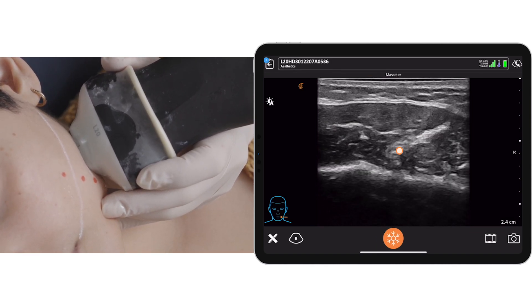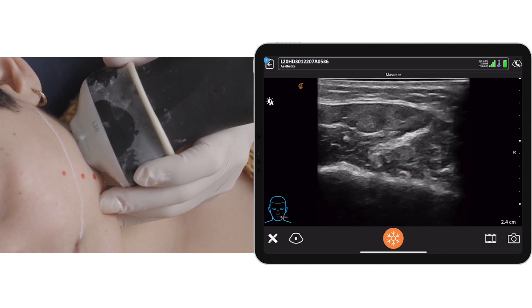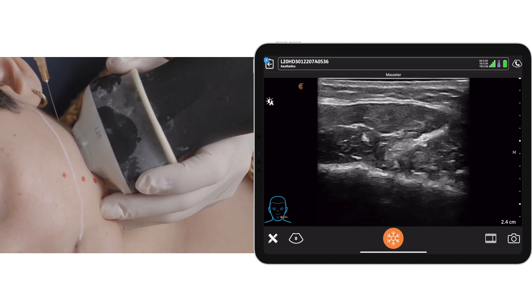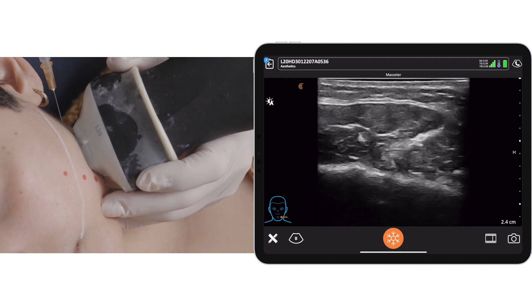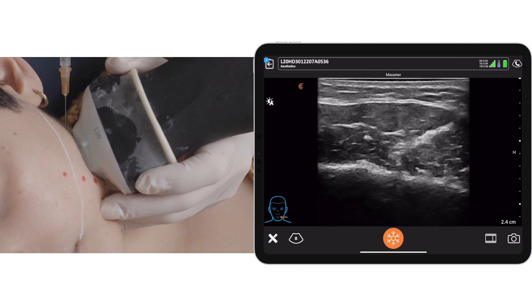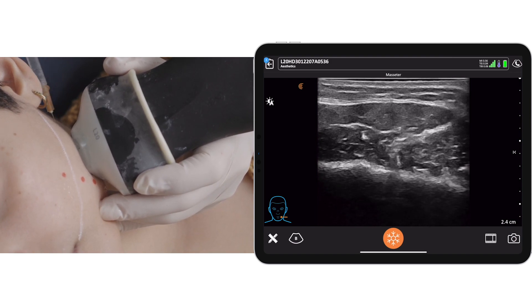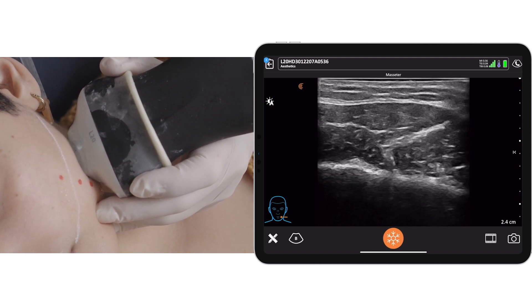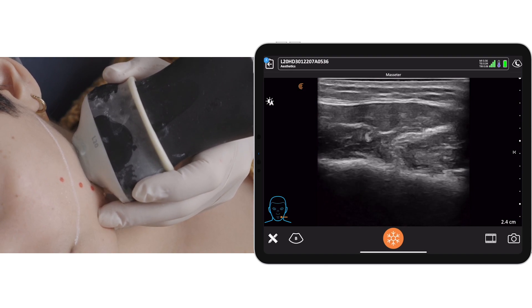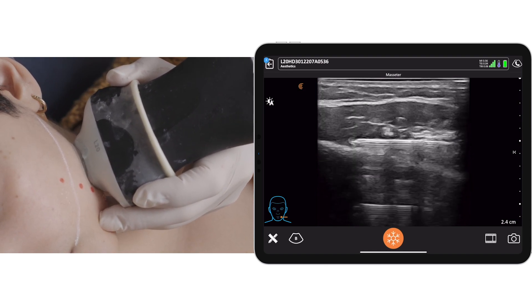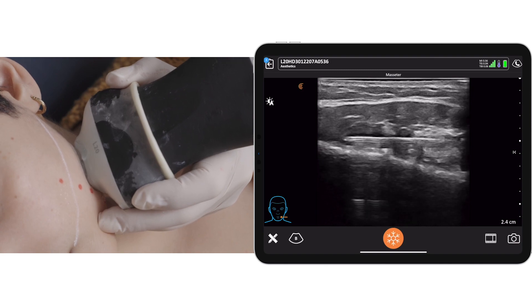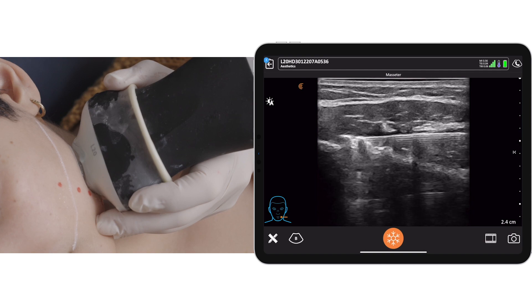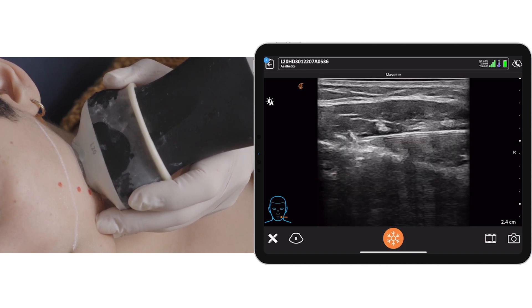I want to do one injection point so that I can target all three muscles. Little sting coming your way — ready, one, ready two. I'm now locating my needle. On ultrasound I can see the movement, and there I have it — this is the intermediate head, so I'll inject a third of the dose into the intermediate head.